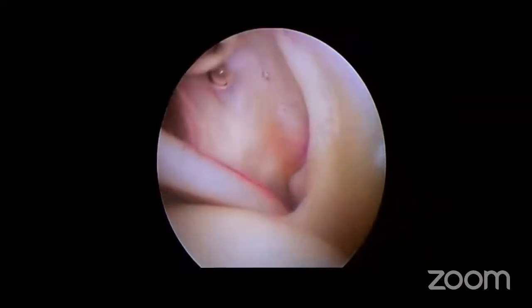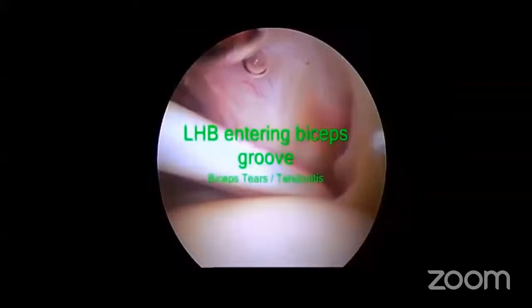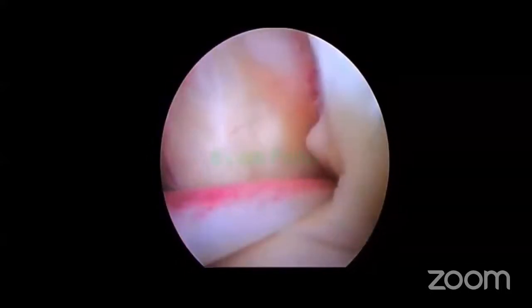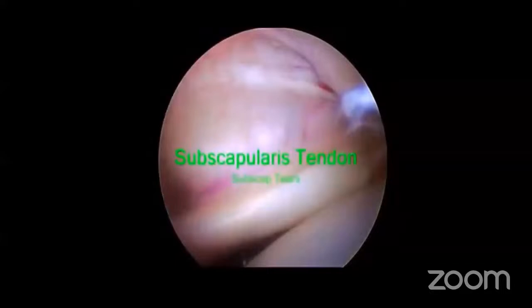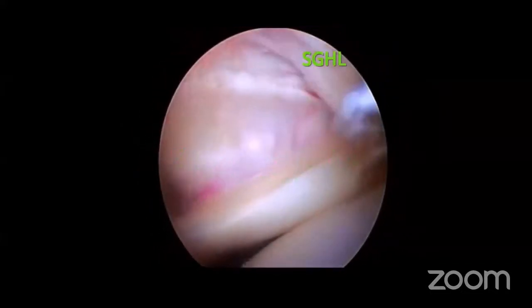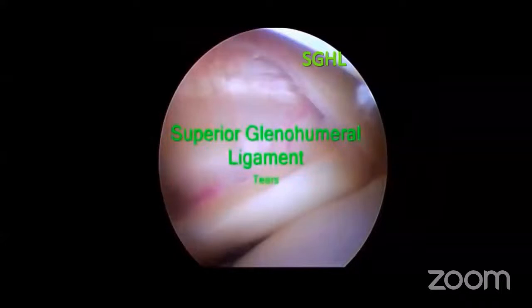And as you sweep your arthroscope more anteriorly, you start seeing the long head of the biceps as it enters into the bicipital groove. This is a point where you could look for any tendonitis or any long head of biceps fraying or tears. You can observe the biceps pulley. And as you sweep your scope from under the long head of biceps, you start seeing the subscapularis tendon, for any subscapularis tears. A little superior to that is your superior glenohumeral ligament.